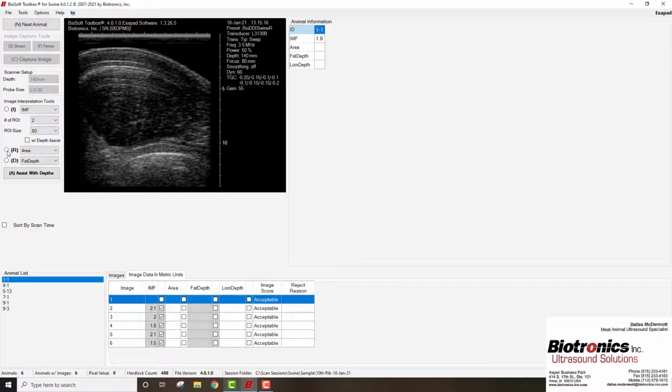And so for this one, where we've got a cross-sectional image, and we've actually got the loin area that we're taking a slice of here. If we want to measure the area of this, and I'm not sure if this one's set up as English or metric, either way, what you can do is click that area icon, take your cursor, and then trace this loin. And the software will predict what the area of that is. It's set at metric, 64.5 square centimeters is what that measures.